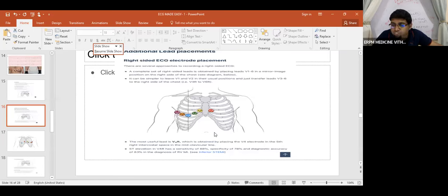Now, the names V1 to V6 are already taken, so for these leads we give another name.